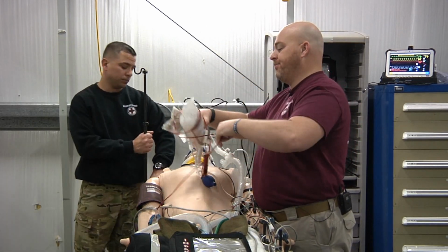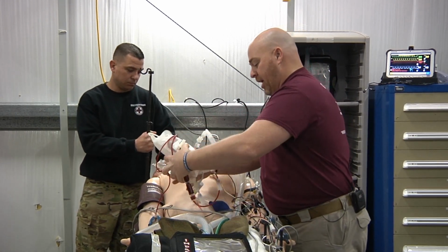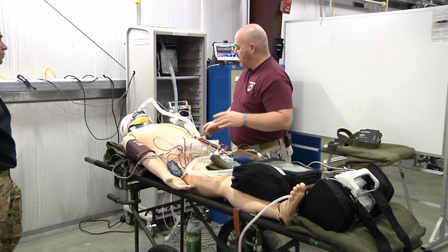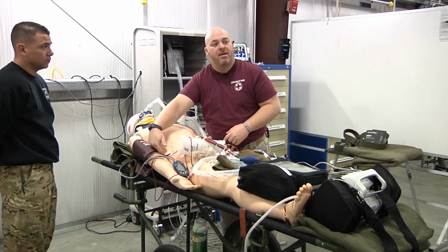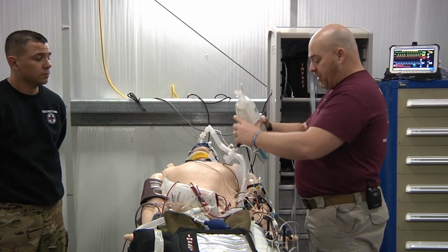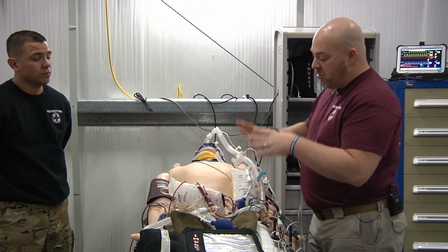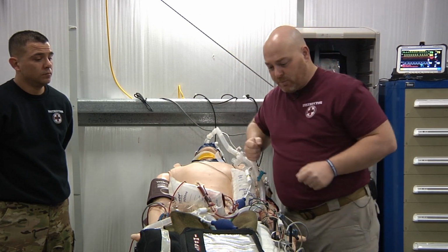I will wind them up and I will put them at the port in which they're located. This gives me easy access, so I know that my blood is at the central line right there. If I had a peripheral line, I would wind it up and I would put it here at my right-sided AC, and my A line is going to be wound up and put right here inside at the A line. Okay, this lets me know, so as soon as I get into the aircraft, I can just pick them up and hang them above the patient. Okay.